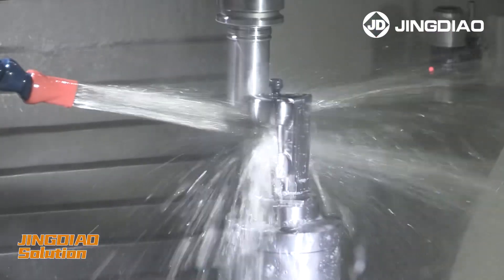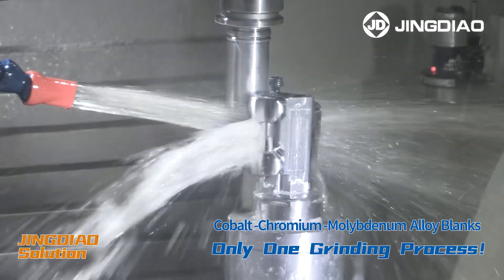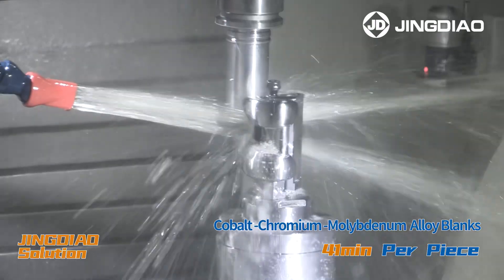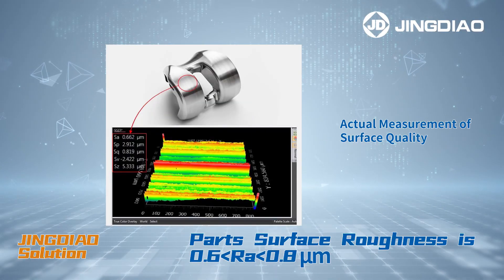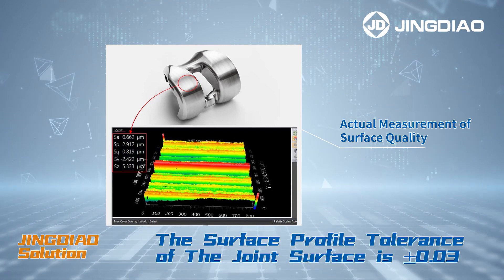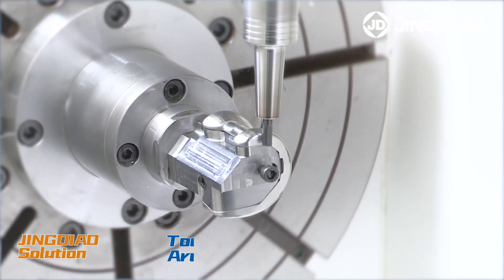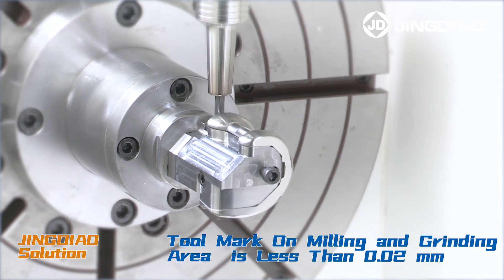Only one grinding process is required for cobalt chromium molybdenum alloy blanks, which significantly reduced machining time to 41 minutes per piece. Part surface roughness is 0.6 to 0.8 micrometers. The surface profile tolerance of the joint surface is within 0.03 millimeters, and the toolmark on the milling and grinding area is less than 0.02 millimeters.